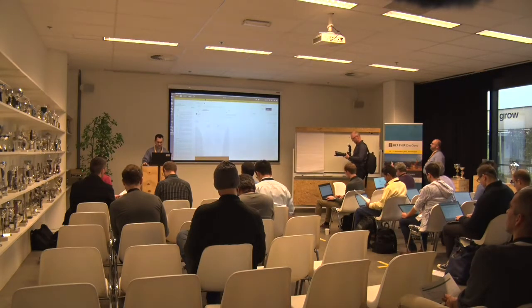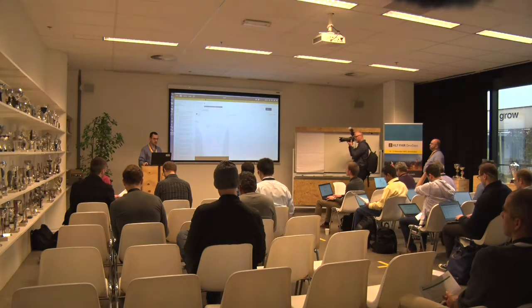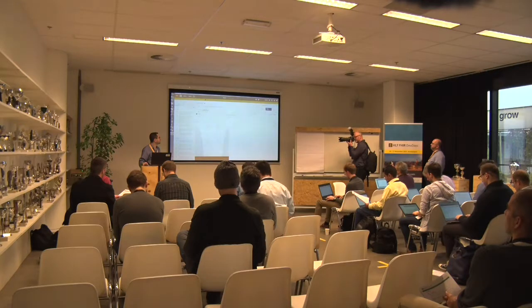So I will paste that URL, and again, ignore the image. This is left over from yesterday. All I'm doing here is putting in the URL, and I added a header, which is the API key. There is a second one here, but this one is not activated. There's no check mark next to it. So it's really only this API key header right here. Okay, I'm going to hit send.